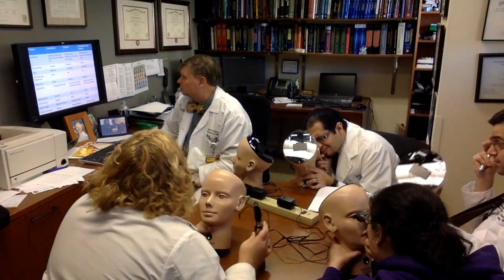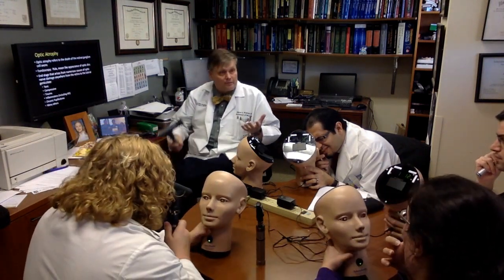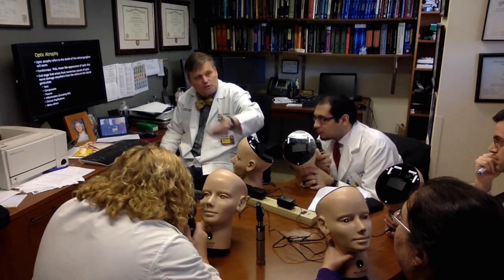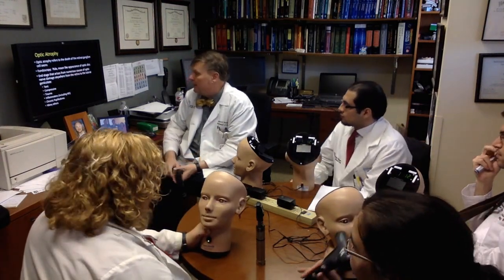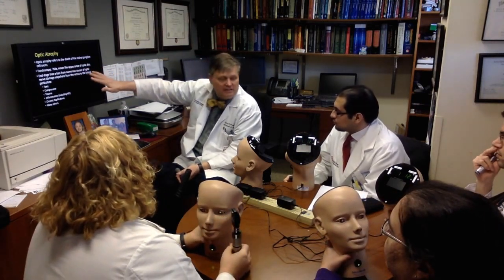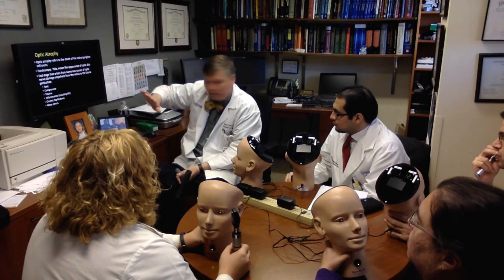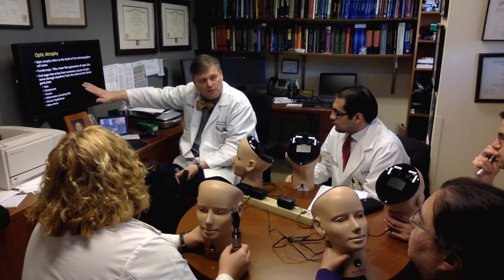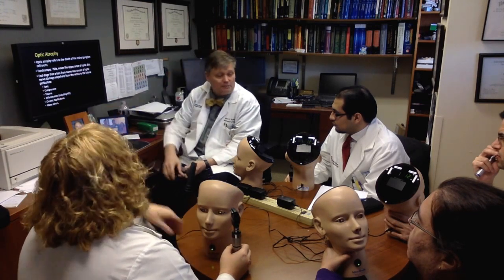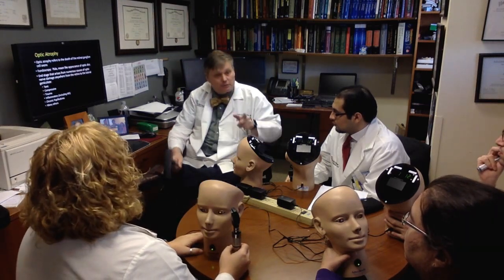All right? Now, let's go this way. Optic atrophy refers to death of the retinal ganglion nerve axons. We've actually killed off the nerve fibers of the optic nerve. The fundoscopy looks like a pale moon, right? This is an end-stage thing that happens to anything that causes optic neuropathy. So it could be toxic, it could be B12 deficiency, it could be compressive, it could be trauma, but in our business, it's most commonly seen with MS or optic neuritis. Not optic neuritis today, but optic neuritis in the past.